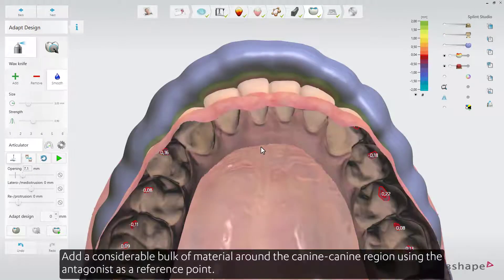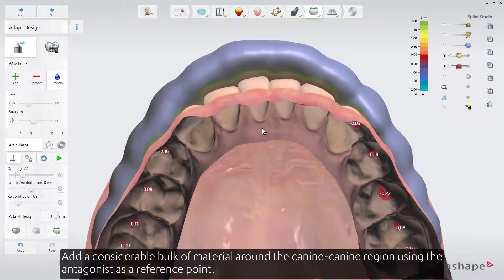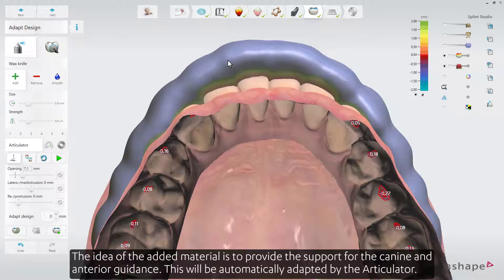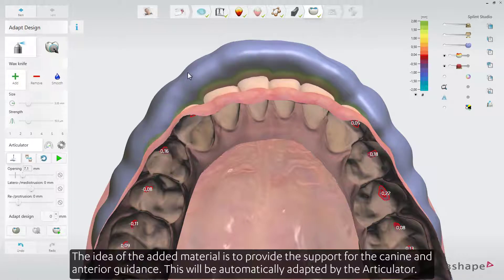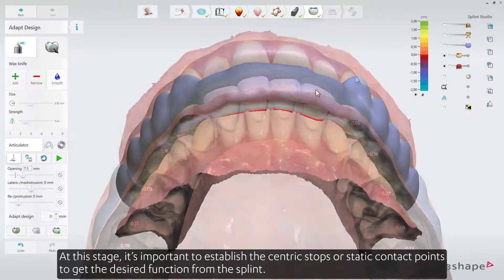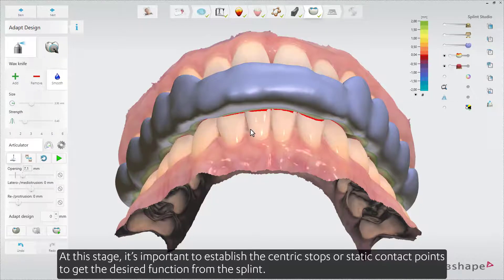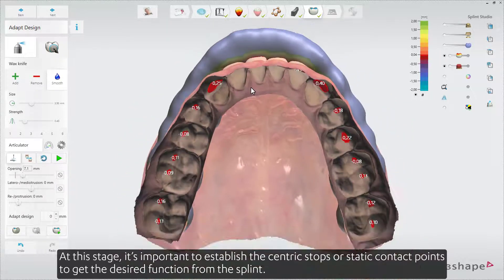Add a considerable bulk of material around the canine to canine region, using the antagonist as a reference point. The idea of the added material is to provide support for the canine and anterior guidance. This will be automatically adapted by the articulator. At this stage, it is important to establish the centric stops, or static contact points, to get the desired function from the splint.